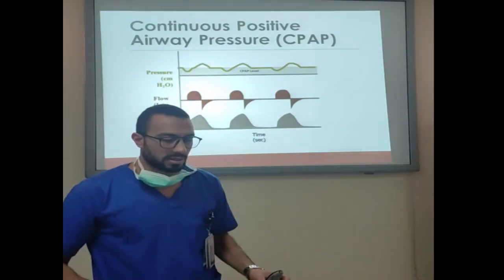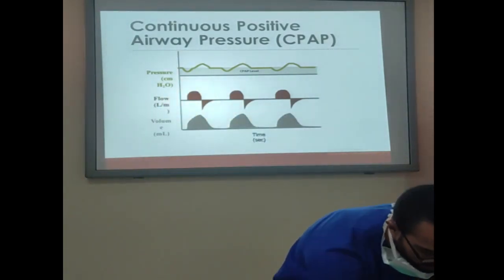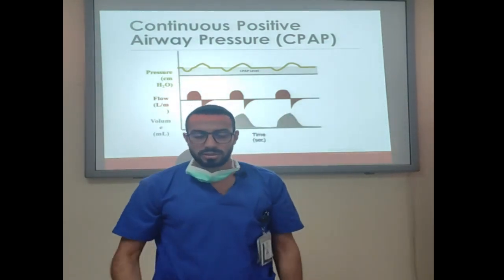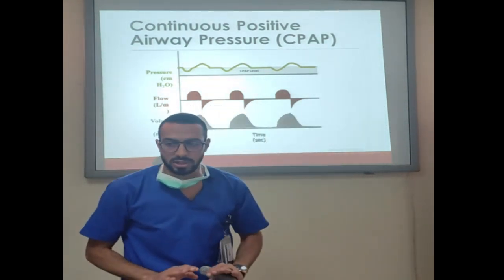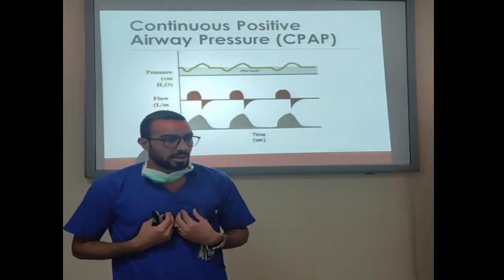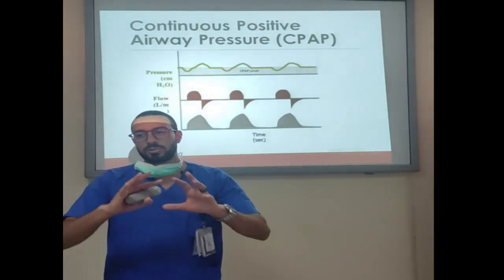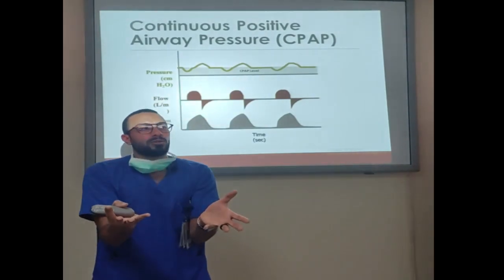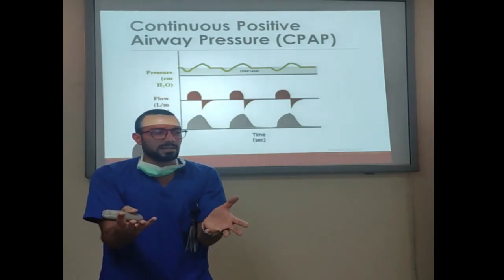If I move this object like this, I will have a specific effort. But if you are on the other side, trying to push a little, my effort will be less, right? This is the PSV. It will give you an environment of high pressure. So your trial is good, is easy for you.